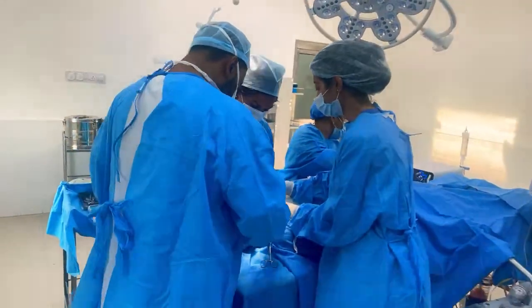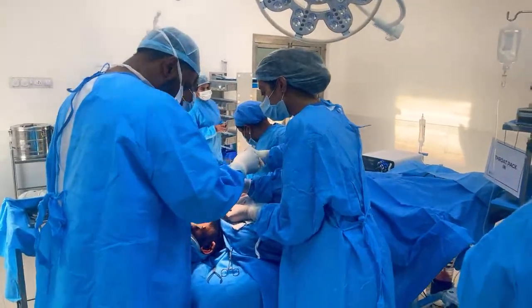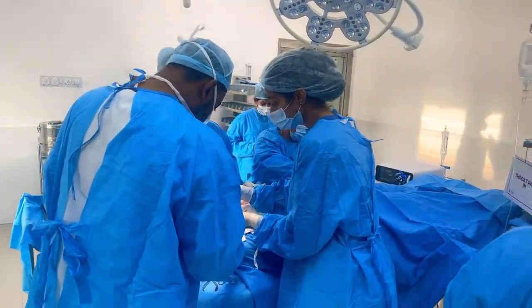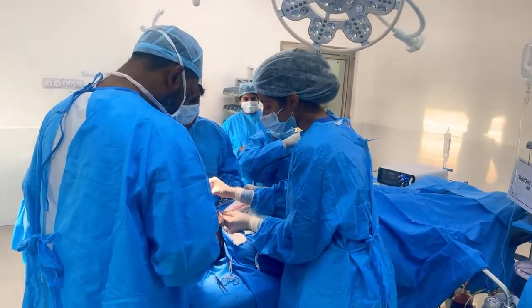The instrument that you see there, which is keeping the segment intact, is called an Alice forceps. And now we are going to do plate bending followed by fixation.